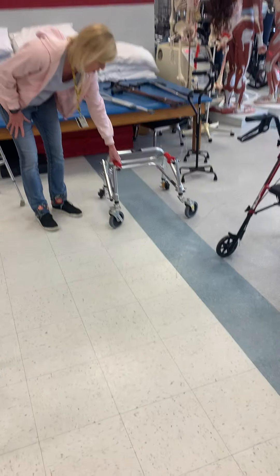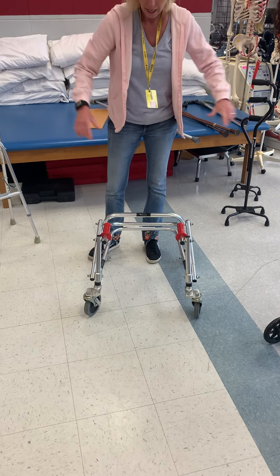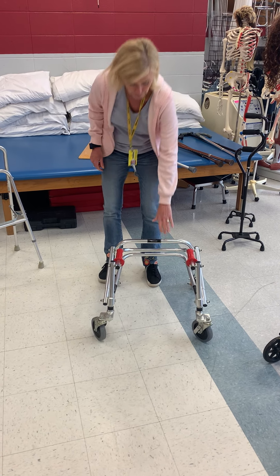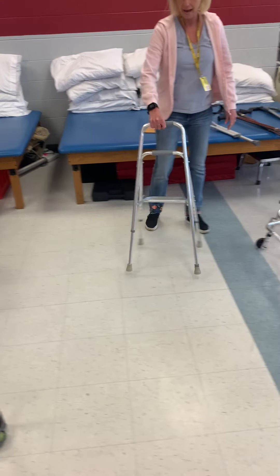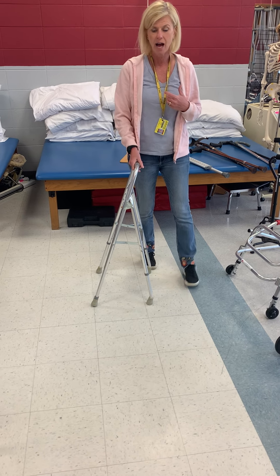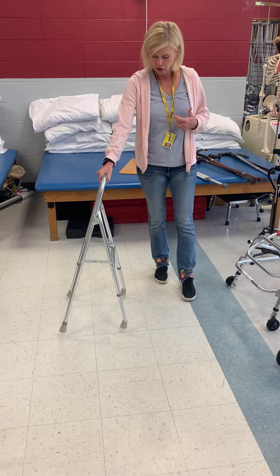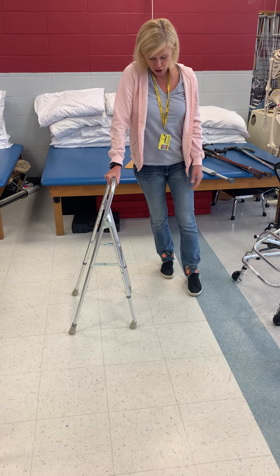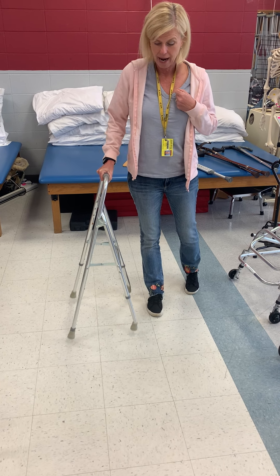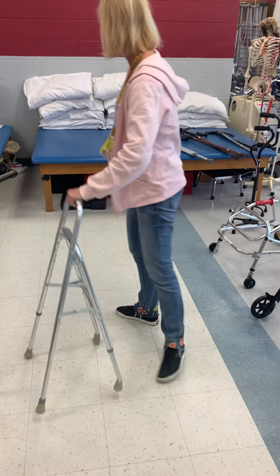This is a reverse pediatric walker. The patient stands with this area of the walker behind them. And this is called a hemi walker. Hemi walkers are used for patients that have a non-functioning upper extremity, such as somebody who's had a stroke. With the hemi walker, they're going to be out to the side — they may have an injured or limited leg, and they would ambulate moving it forward like that.